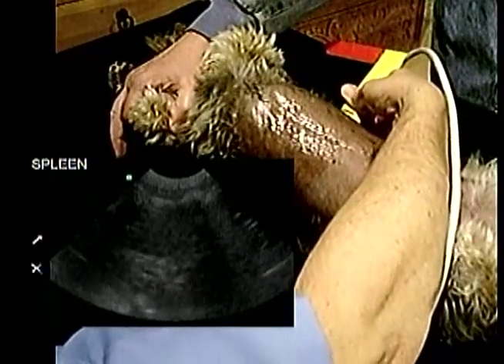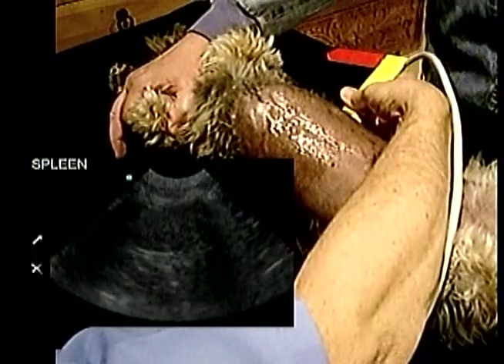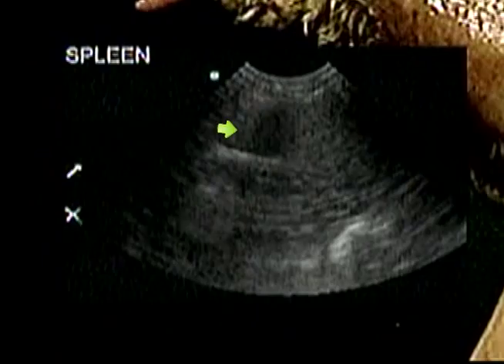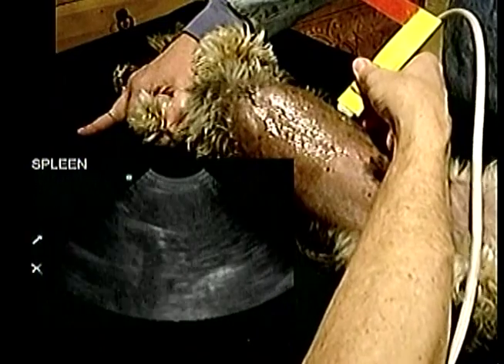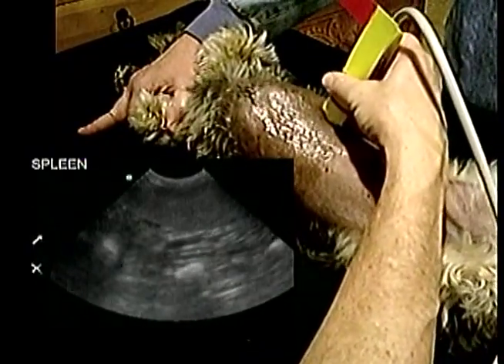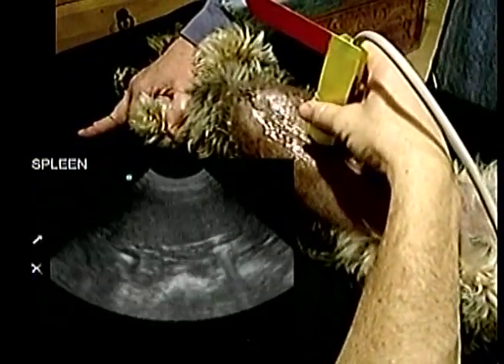All patient data should be considered when there is a loss of homogeneous parenchymal appearance of the spleen. Does the patient have any known disease processes, symptoms, laboratory results, or other ultrasound findings that may be related to the splenic lesions? The lymphoid hyperplasia in this dog was rechecked by ultrasound every 3 to 6 months for 3 years, with little change in size, shape, or appearance. This patient has chronic inflammatory bowel disease, which may be related to the splenic lymphoid hyperplasia.